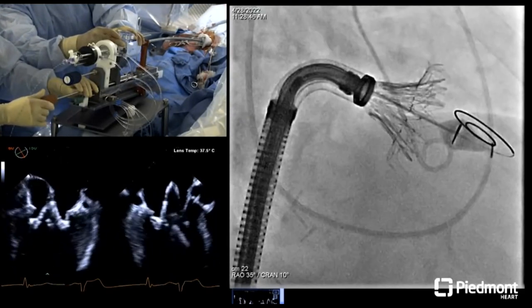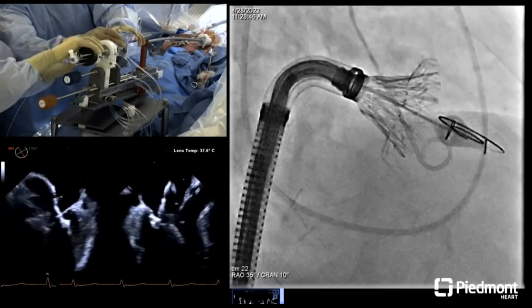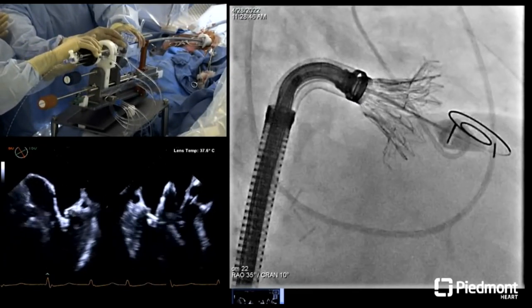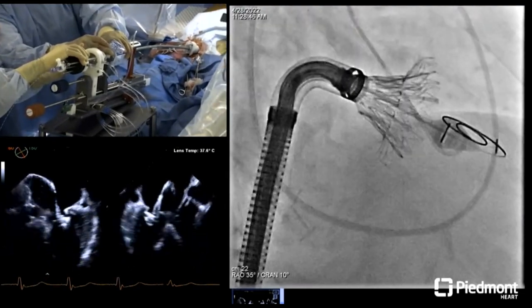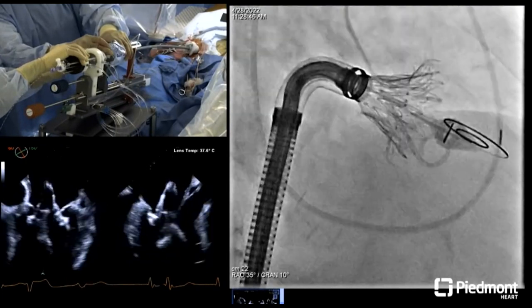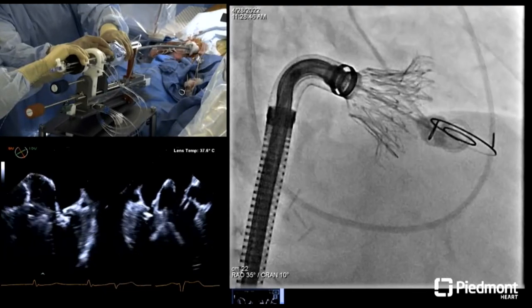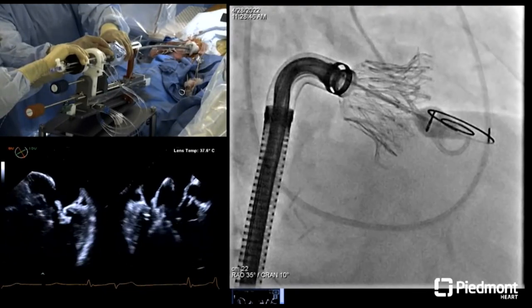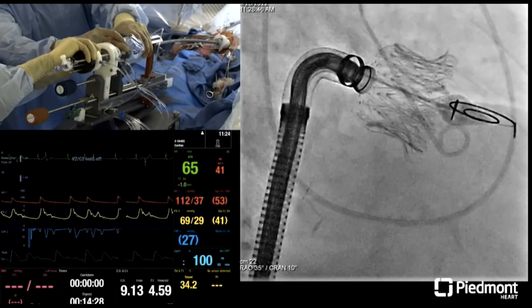Keep opening, that opens the middle portion, and then you advance that white puck that will open the atrial side of the disc. And I didn't show you the time on that fluoro screen. When we were crossing the septum, it was 10:55, and you can see it's 11:28. So about 30 minutes from transseptal crossing to really full deployment of the valve.